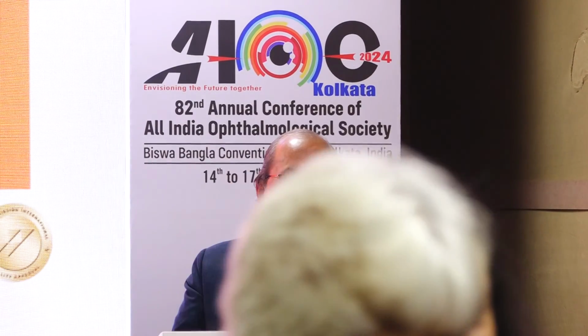We go to the next instruction course, that is surgical management of pediatric cataract, video-based learning. I am Dr. Jagat Ram, and with me faculty is Dr. Jaspreet Sukija, who is Professor, Department of Pediatric Ophthalmology and Strabismus at PGIMER Chandigarh. Dr. Parul Chawla Gupta, Associate Professor, main interest in pediatric and does all cataract, cornea and refractive surgery.